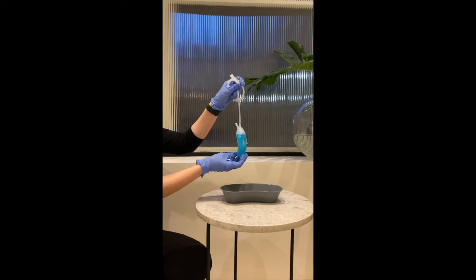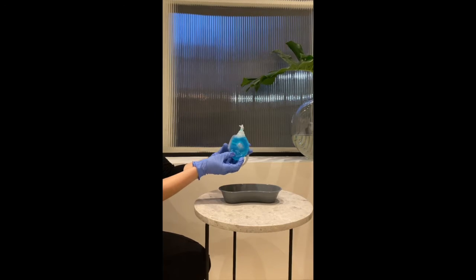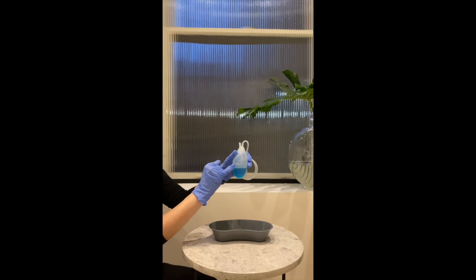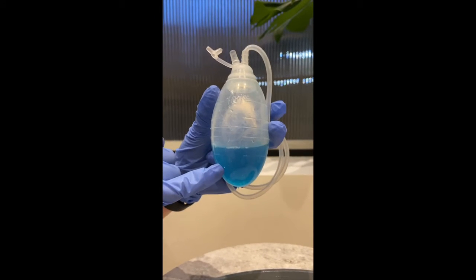This is how to take care of your drains at home. Hold the drain and open the cap very carefully. Once opened, measure and record the output. Bring these records to your next appointment.